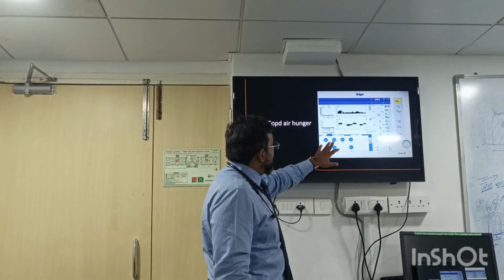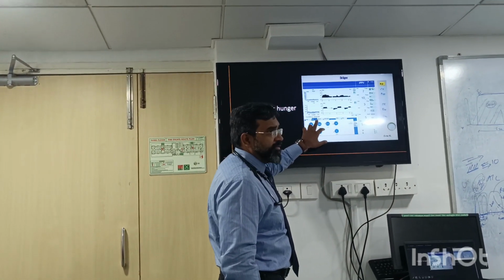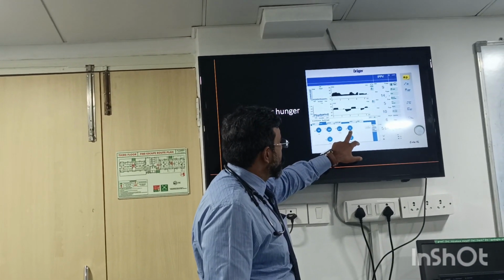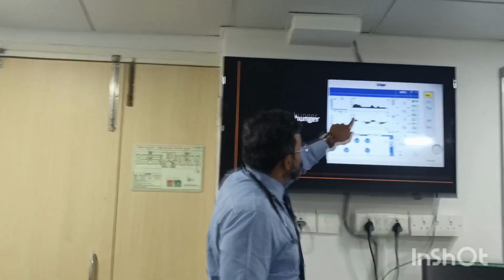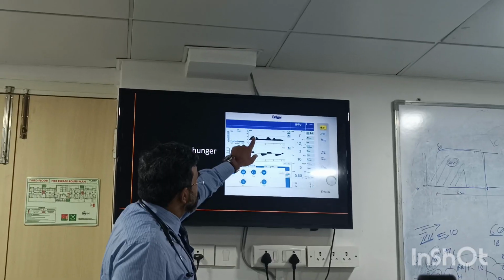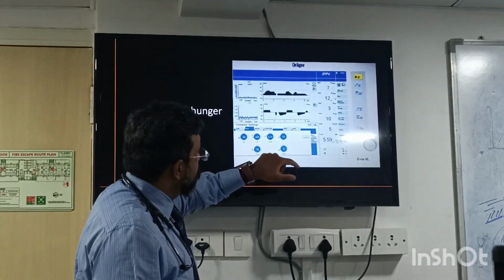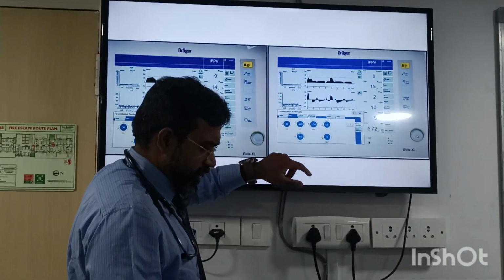So you have set a tidal volume. This is called IPPV here because you set a tidal volume, volume control. You have set a frequency. You have set an I:E ratio. Now what is happening over here? There is an inspiration, expiration coming in. Now let me just show this again to you.